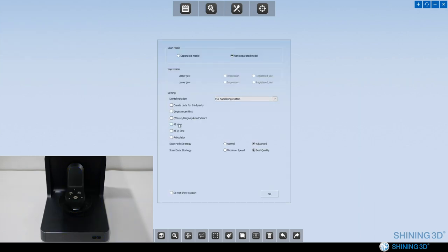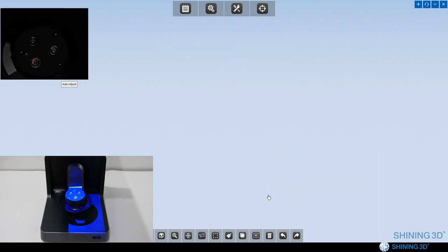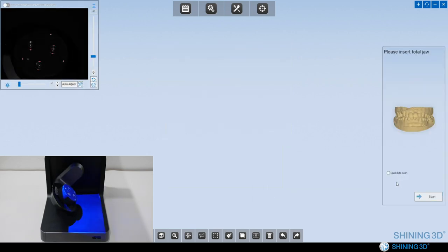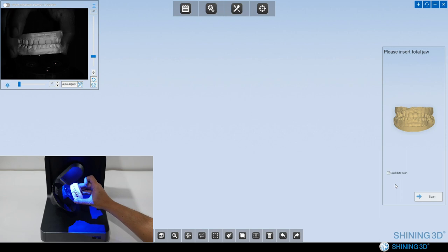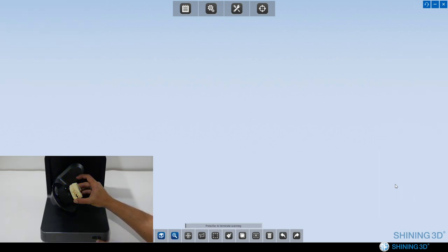We need to activate the option all in one, but if you want, you also can activate AI scan function. Click OK. Activate quick bite scan. We always want to use the easiest way to scan the bite.